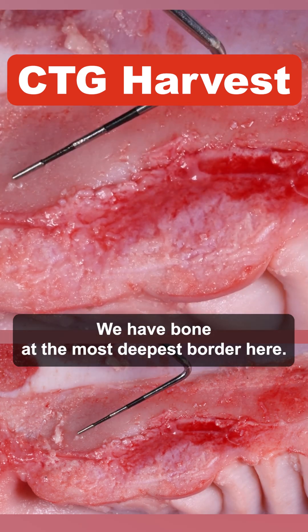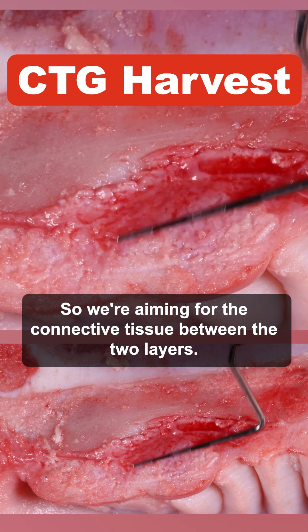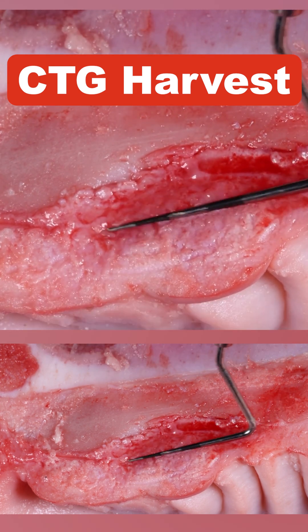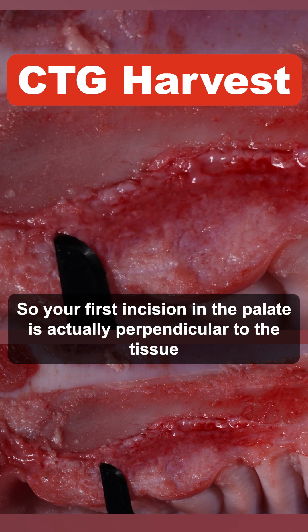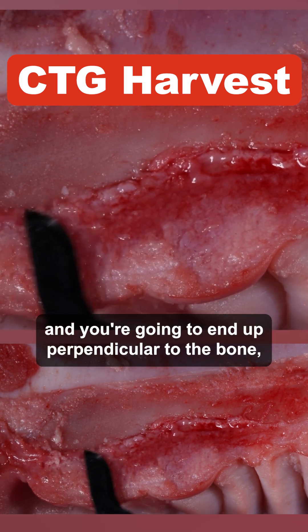We have epithelium on the surface and bone at the deepest border. We're aiming for the connective tissue between the two layers. Your first incision in the palate is actually perpendicular to the tissue, and you're going to end up perpendicular to the bone.